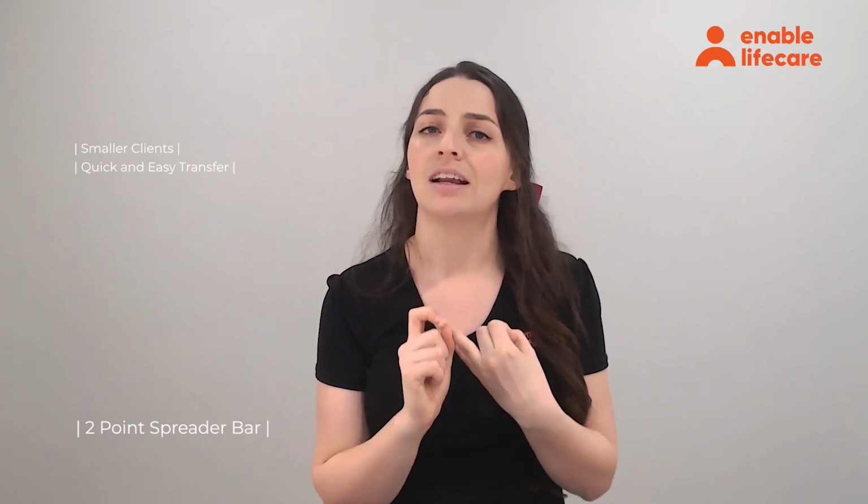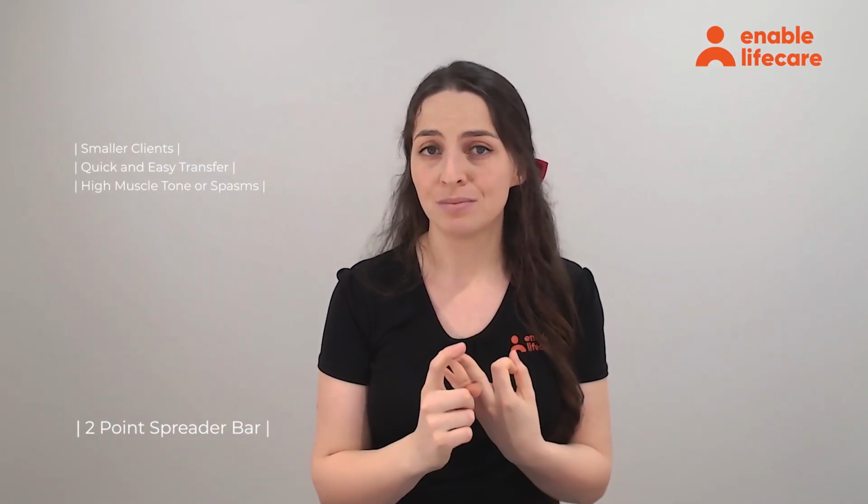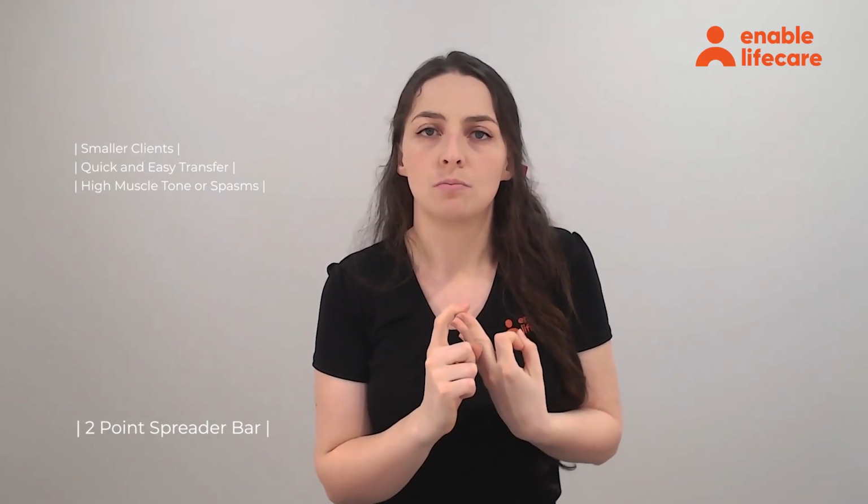Just a recap, your 2-point spreader bars are suitable for clients that are smaller, need to be transferred very quickly and easily, and clients that have either high muscle tone or spasms and need a closed postural sitting position. Now we have our 4-point spreader bar. This is more open and a natural sitting position, and it's ideal for those larger bariatric clients, and it gives you easier access for toileting and other medical procedures.